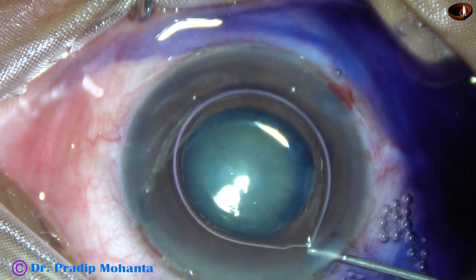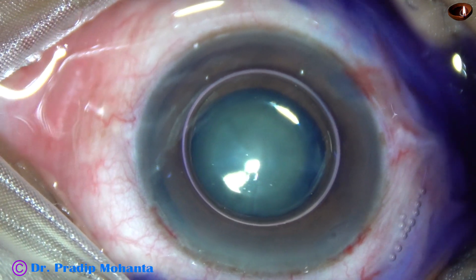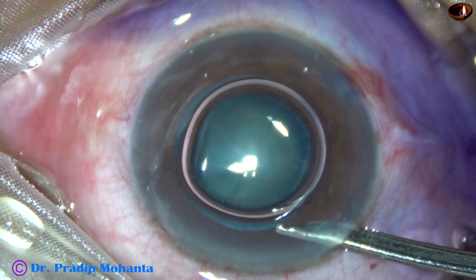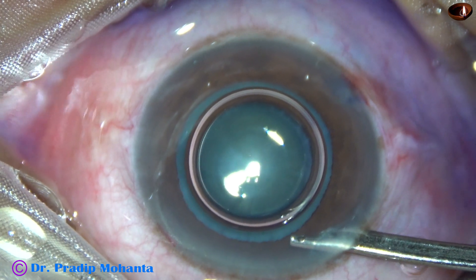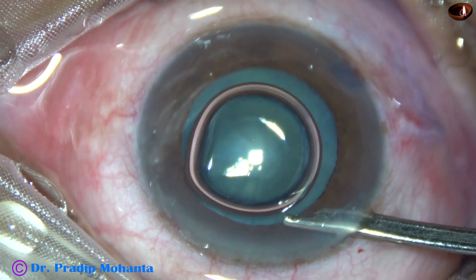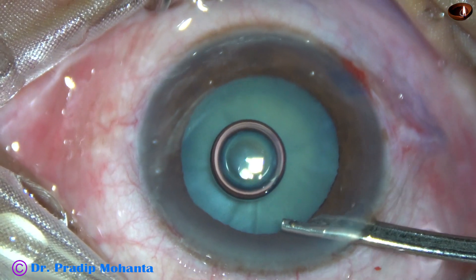This is adrenaline. The pupil was not fully dilated in this case, so I applied a bit of adrenaline and it worked. See, the pupil has dilated quite a bit after application of adrenaline.